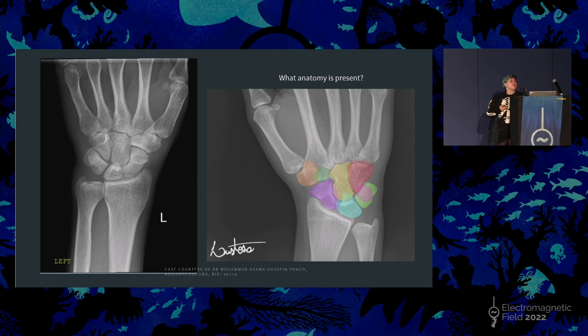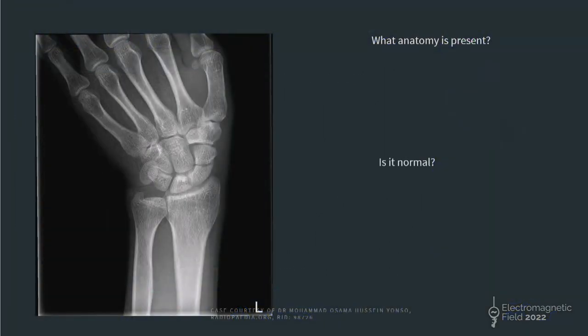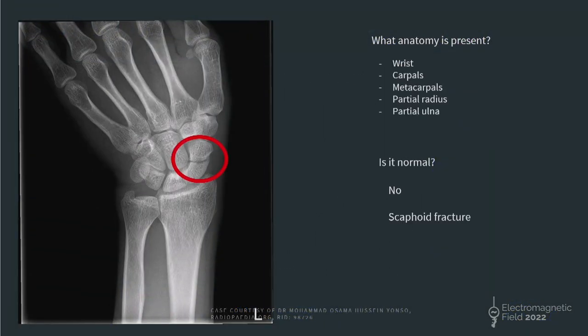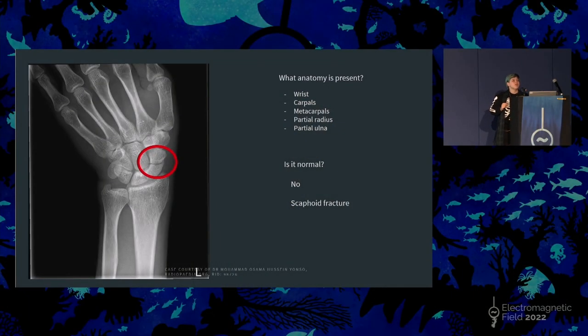Orange. Orange is not broken. Anyone else? Red is not broken. Now, can you see the break now? It is purple. Yeah? So that is why if we expect that there's a scaphoid fracture, we have to do a scaphoid view where you turn the wrist. And I can tell you now, anyone who has a scaphoid fracture is going to scream when you get them to do that. Because as you can imagine, we're essentially opening up that break.